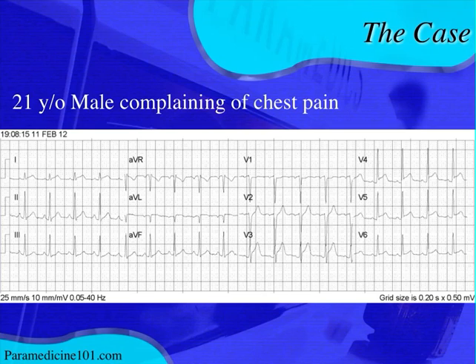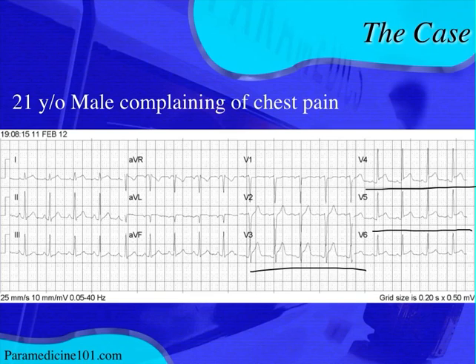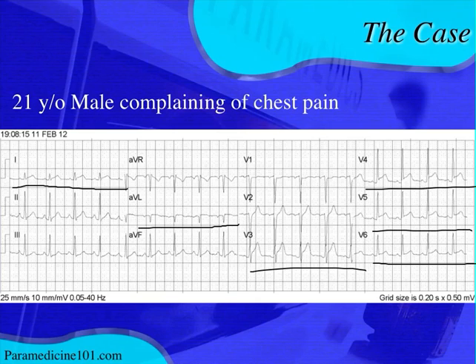Now we're going to look for ST changes — the ST segment and T wave. We do see some: ST elevation in V3 and V4, V5, maybe a little bit in V6, as well as maybe a little bit in lead 1 and AVL. This could be a myocardial infarction pattern, so we have to be concerned. We need to get more information from the patient — an OPQRST, a good SAMPLE history — to determine more what's going on based on their presentation.